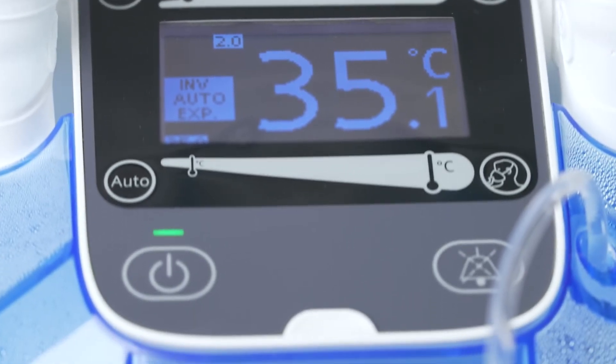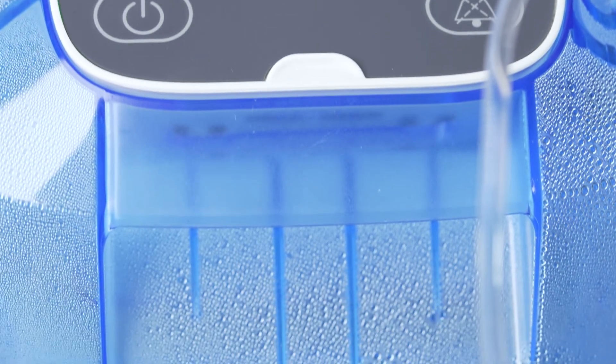Keep in mind that the humidity setting is optimal when a fine, breath-dependent fogging forms in the tube, flex tube, or flow sensor.